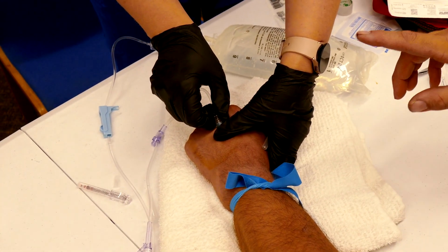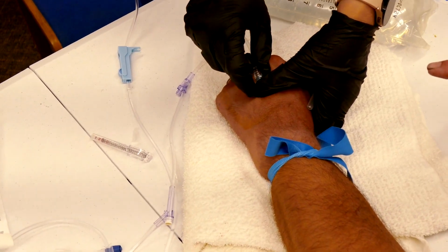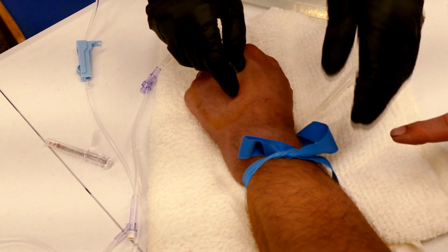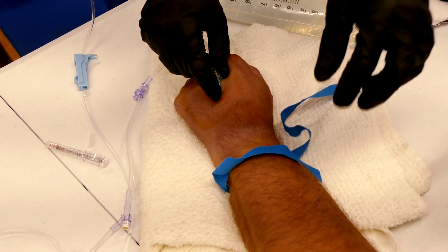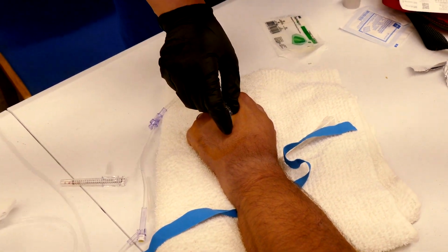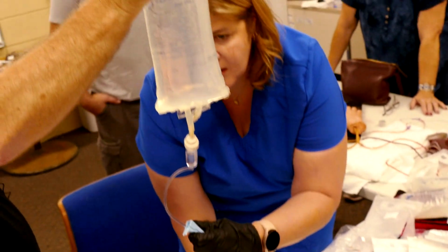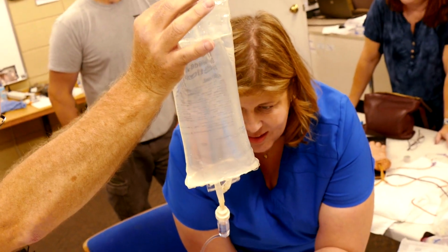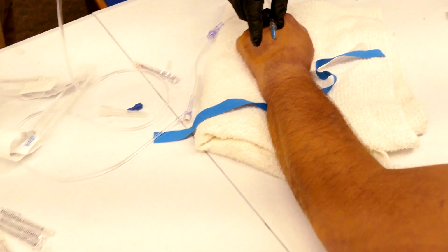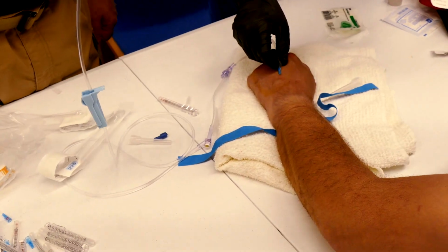I can release my left hand, just as long as one hand is always in control of that line. So as long as this one's under control, good. Now pop that. Now lift that. I'll be your IV pole. Now I'm going to open it and make sure. Hopefully we made it instead of bounced off the side. I'm not sure, to be honest with you. I'm guessing we're not in. And now see, I'm filling. Close it.